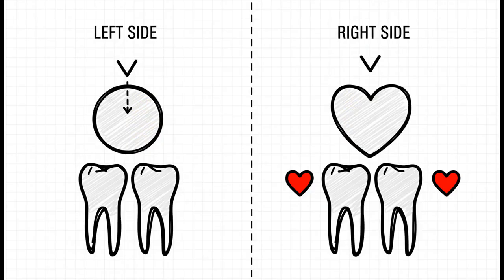This is the nasopalatine duct cyst. You'll find it right in the midline of the upper jaw between the two central incisors. And crucially, those incisors will test vital and healthy. Now, about that heart shape. It's a super cool illusion. It's not actually heart-shaped. You're just seeing the shadow of the anterior nasal spine laid over the top of a round cyst. Pretty neat, huh?